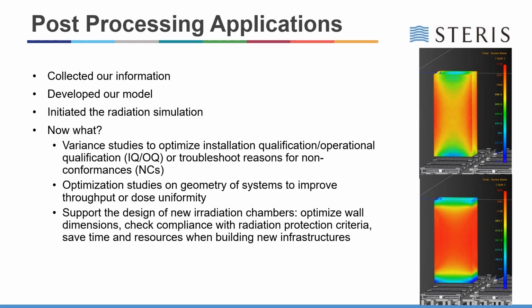So especially considering the impact of the scan width, being able to make these studies in concurrence with operational qualification testing allows a large component of the testing to be unnecessary and optimization to be determined. Furthermore, the non-conformances is a way of being able to selectively remove pieces and parts of a benchmark simulation model and identify the impact that each one of those parts would have.